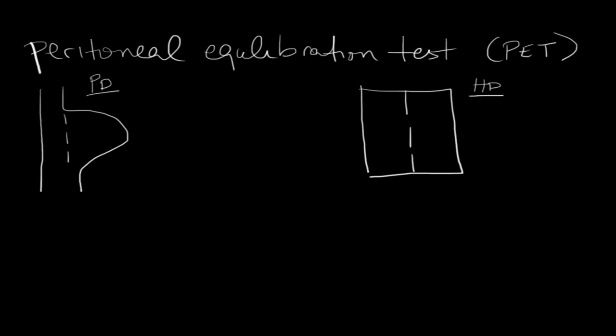Welcome to this last installment regarding peritoneal dialysis, and today we're going to talk about the peritoneal equilibration test. The PET test, as it's commonly known, is a test that's unique to those patients who do peritoneal dialysis. To understand why that is the case, we have to make a little comparison between PD and what we've taught you about PD thus far, and HD, and what we've taught you about HD thus far.